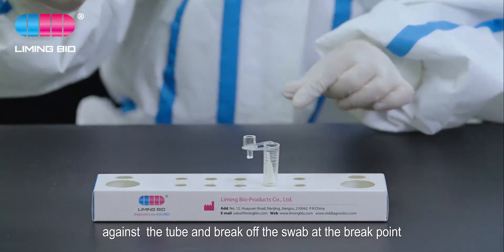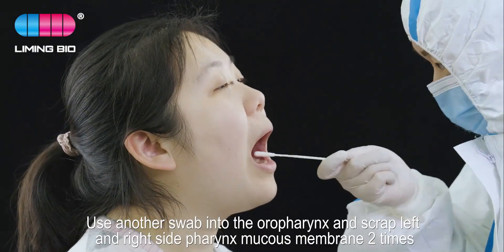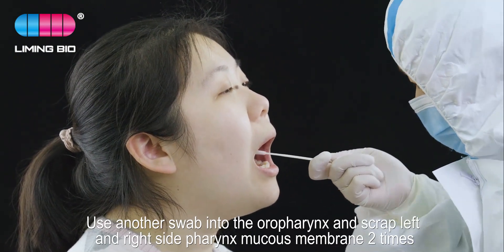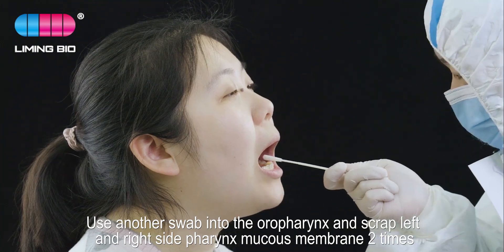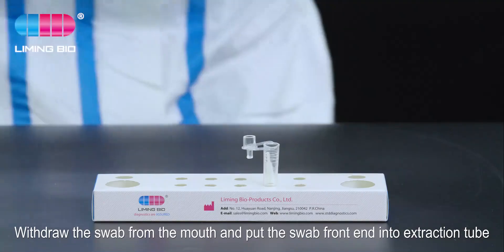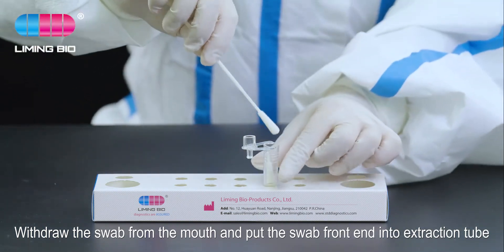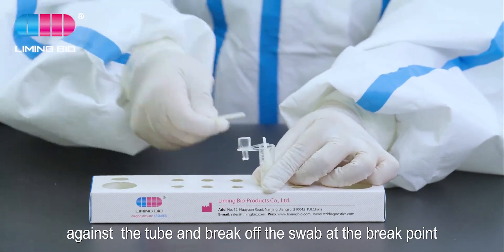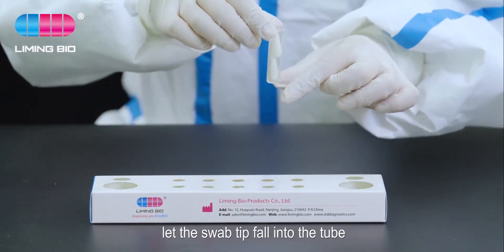Take out another swab and insert it into the oral pharynx. Scrape the left and right side pharynx mucus membrane two times. Withdraw the swab from the mouth and put the swab front end into the extraction tube against the tube, then break off the swab at the break point.